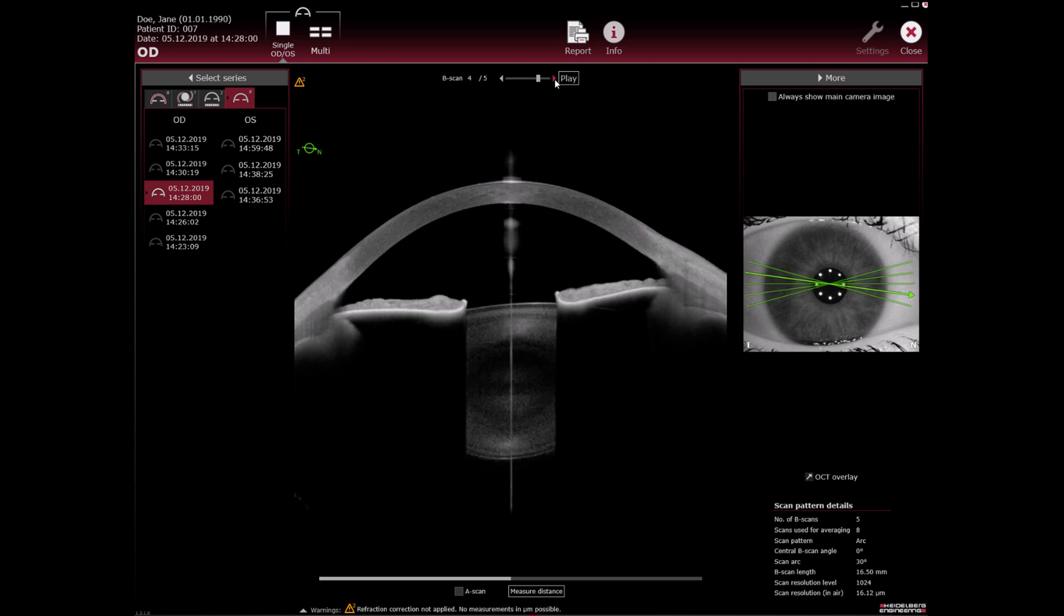Alternatively, scroll through the OCT section images using the mouse wheel. To show the OCT section images as a slideshow, click play.